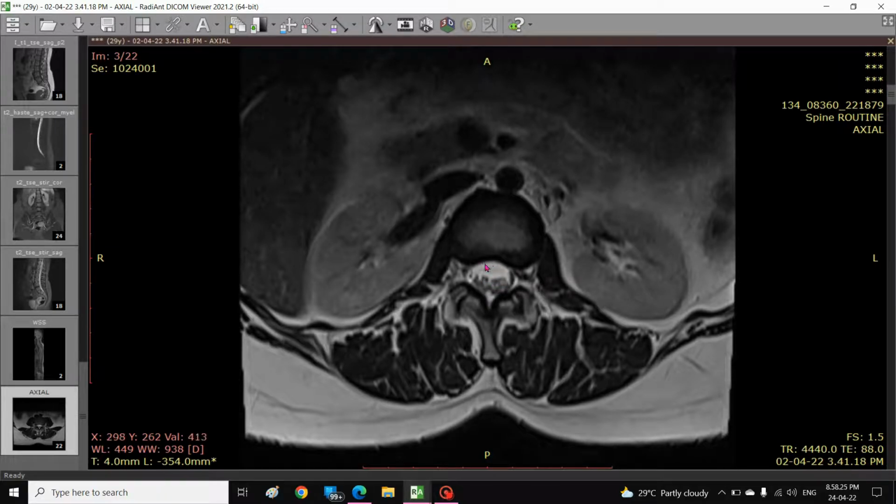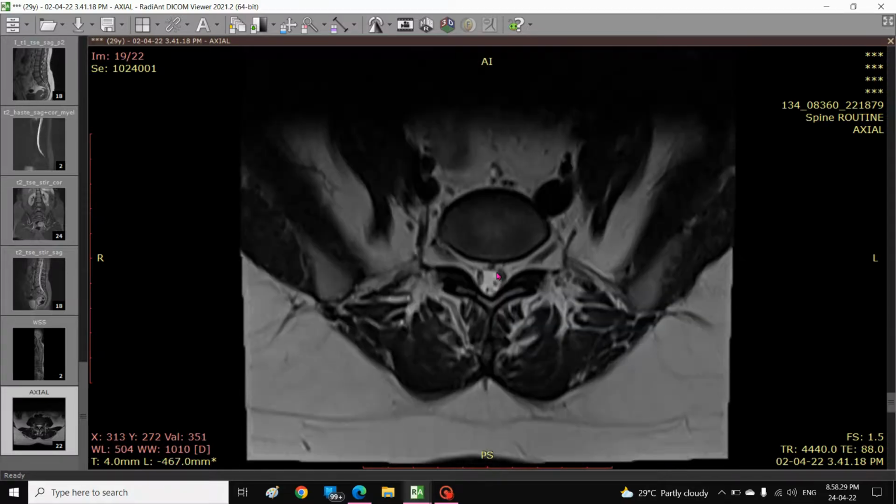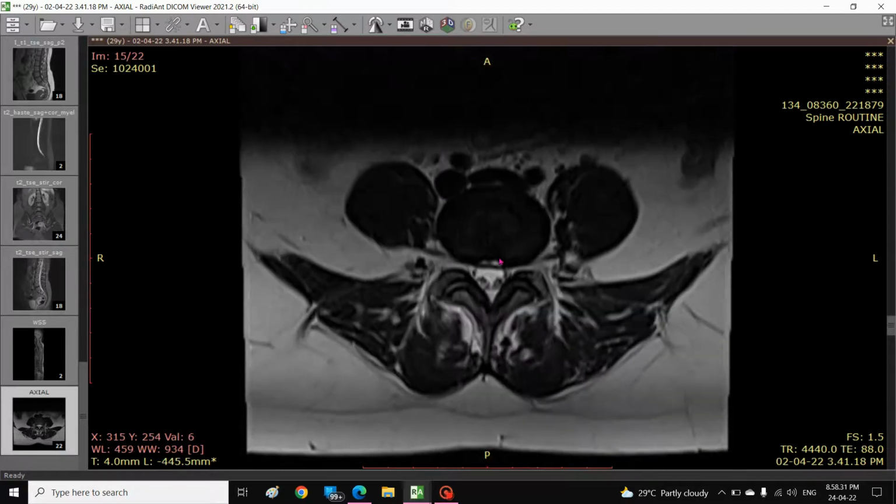Okay, that's very important. But as you go to the lower level, let's say, the L4, L5 disc, which is this one, you could see the concavity in the disc is lost, whereas it's rather convex, and obviously it is causing more congestion and narrowing of the spinal canal here. You could see the PLL here, which we saw in the sagittal view, which is getting stripped off from the posterior vertebral margin.